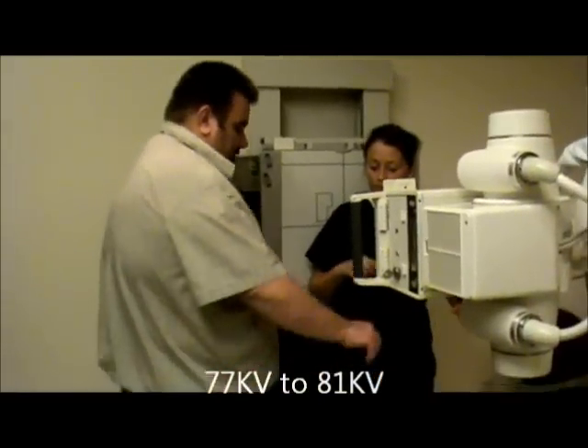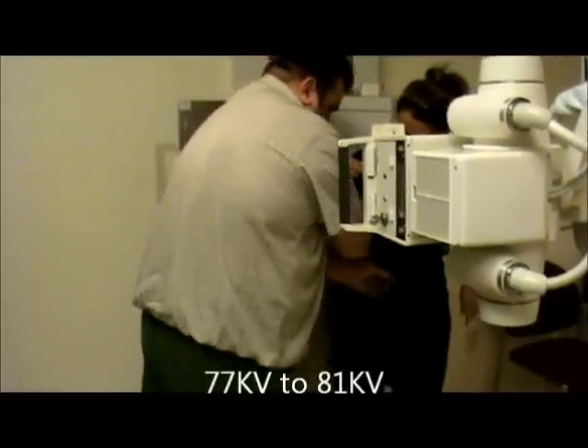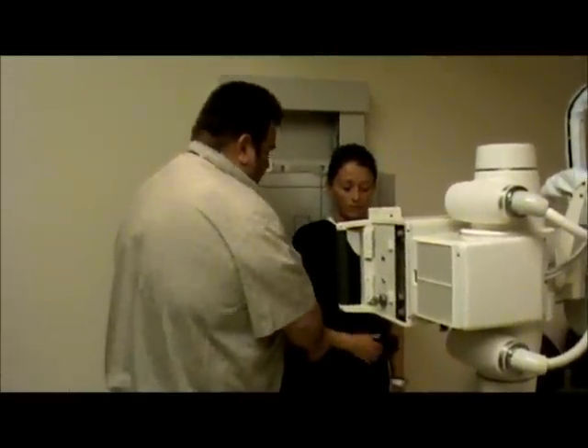Let me go ahead and shield the patient. Have the patient put her back against here. You can bring it on across your chest however it's comfortable for you.